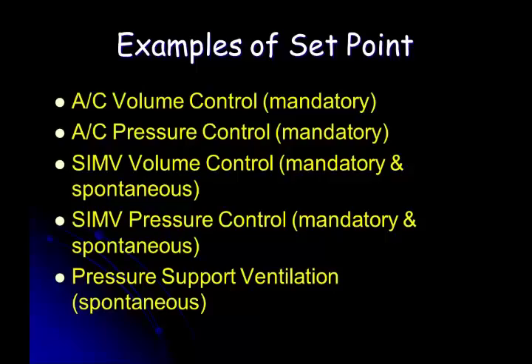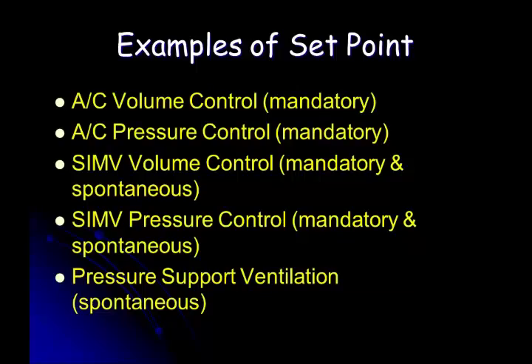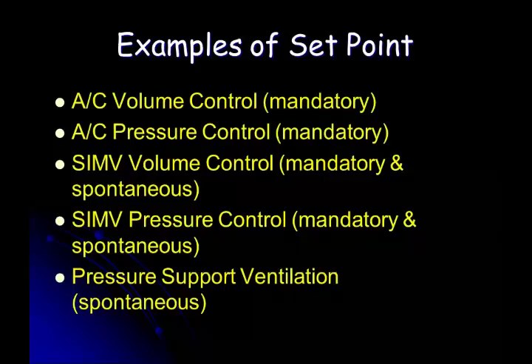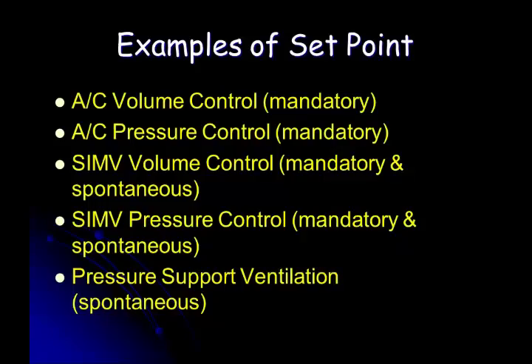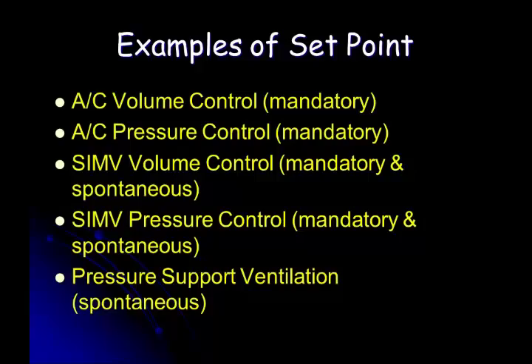The book got rid of the S. They said you might just see it as IMV. This is correct. It's the same thing. Well, technically, for our purposes, no, because there truly is a difference between them. But because there really is no ventilator that does only IMV, we can use them synonymously. But I want to make sure we understand that they truly are two different things.